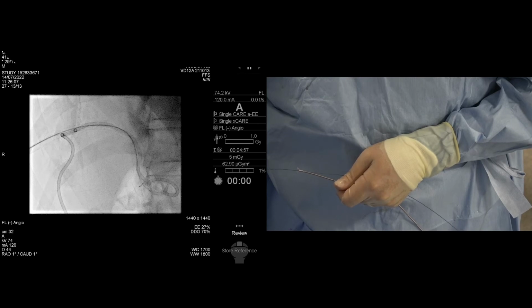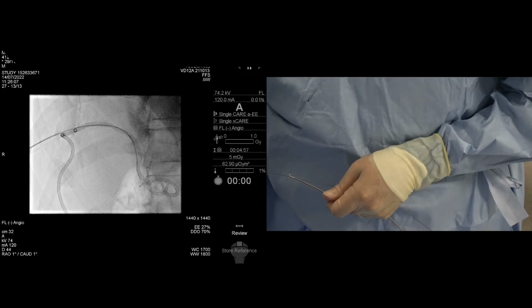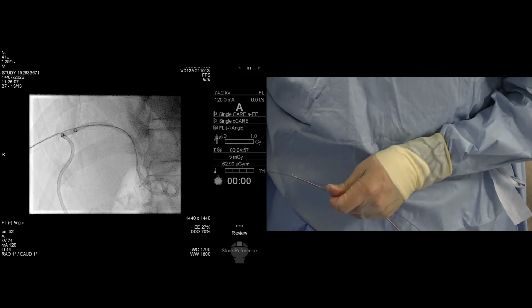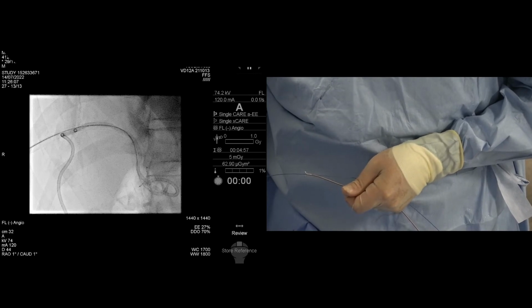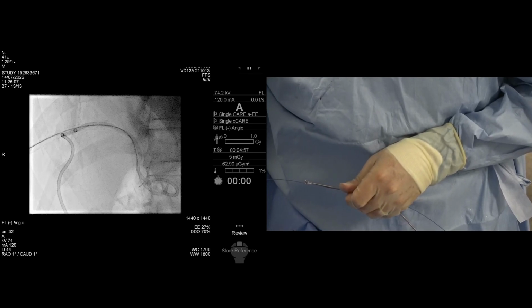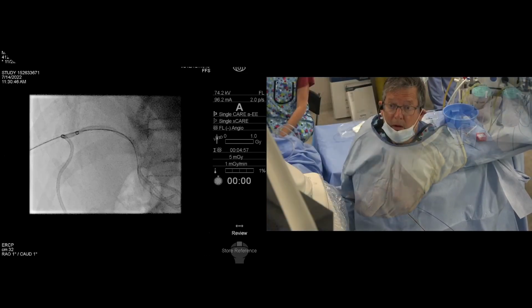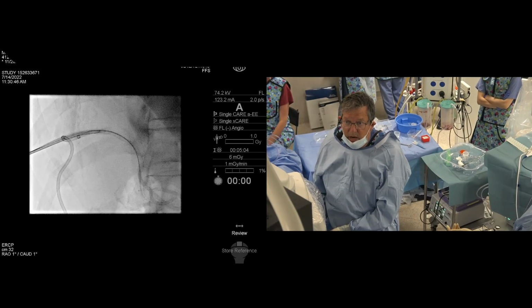And a way to very significantly reduce that risk is if you're not just blindly or fluoroscopically passing the biopsy forceps, but doing it over a wire. And that's where this Steris Histoguide comes in. You can see that we've loaded this biopsy forceps on the wire. You will have seen in other videos that the forceps is secured to the wire just below the biopsy cup, and it allows us to smoothly advance the biopsy forceps into position. And again, you see this coming into position. I think this is a technique that we need to encourage our radiology colleagues to do more of.